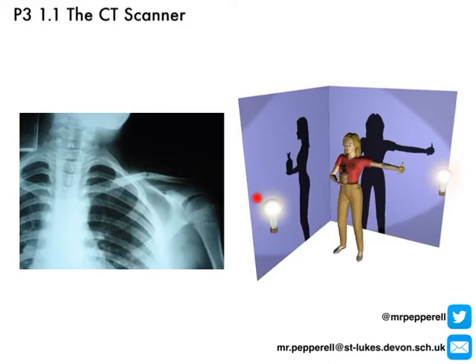And we can see if we look at this picture here, that viewing an object from different positions in 2D gives us a very different image of that object, okay? We can see here that the woman's holding a pineapple, but we haven't got a clue that she's actually holding a banana. And from this direction we can see the banana but not the pineapple.